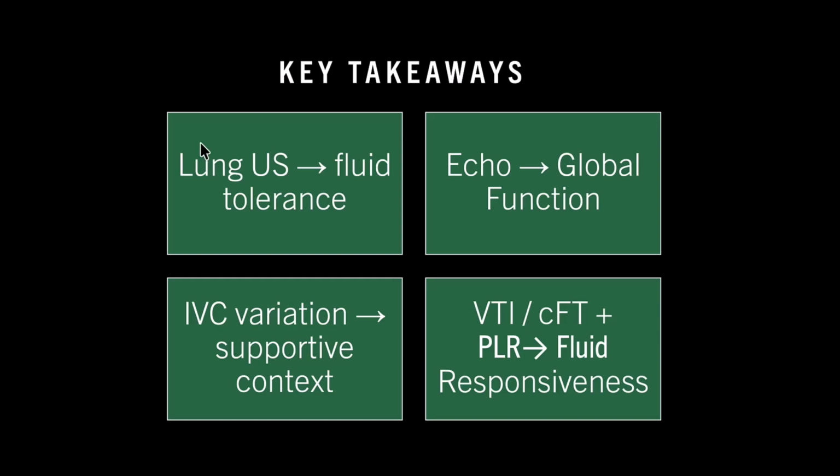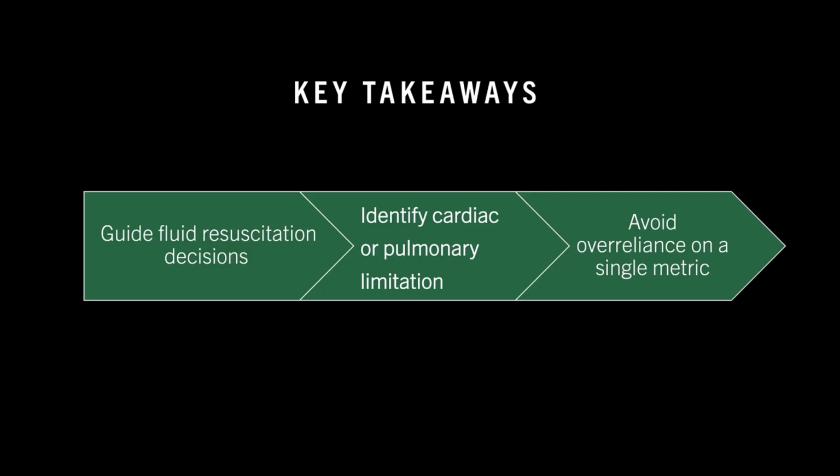We always look at the lung ultrasound assessment for fluid tolerance. We look at the echo as a global assessment of the heart function. We look at the IVC variation to give us supportive context. And now we have these new fun tools, the VTI and carotid flow time, and adding a passive leg raise to assess fluid responsiveness. But again, POCUS doesn't replace clinical reasoning, it is meant to strengthen it.